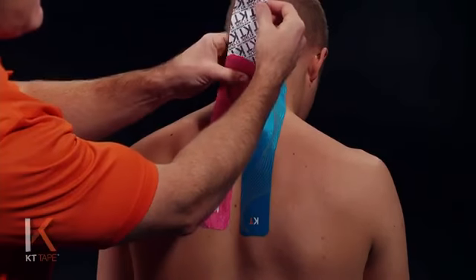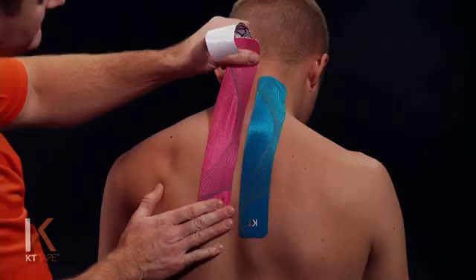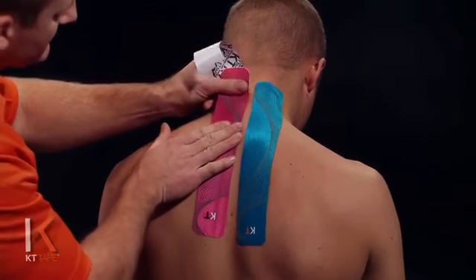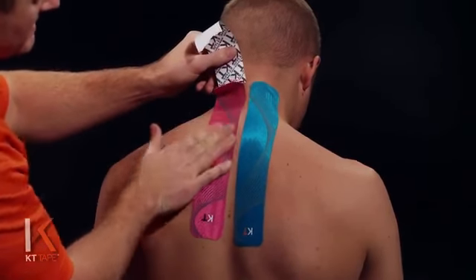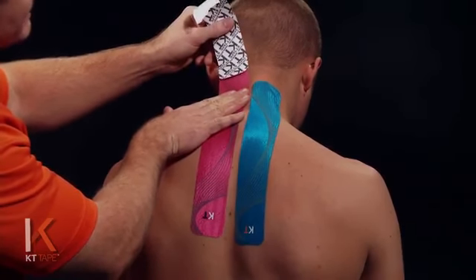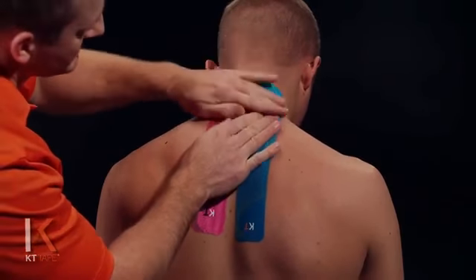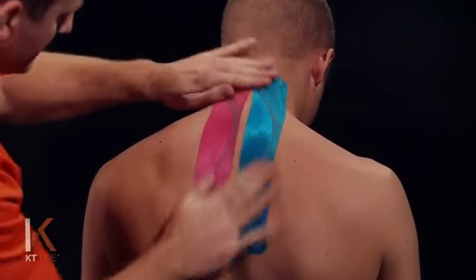I'm just on the muscles on the opposite side of the neck, and just like with the first one, I'm going to apply this with 25% stretch. So stretching that 100%, back that off 50, and back that off 50% again. That should end up at about 25% stretch. I'm laying that down, and I'm now going to remove the backing paper with absolutely zero stretch as I lay that tail down. I'm going to give the whole application a good friction rub there so far what I've done, and I've got one more piece.